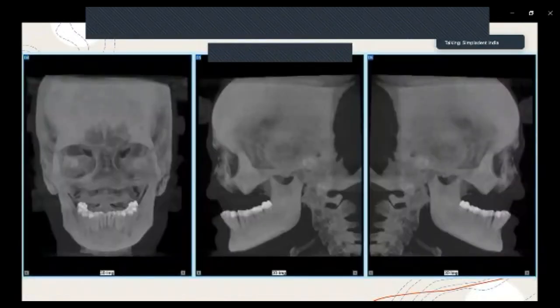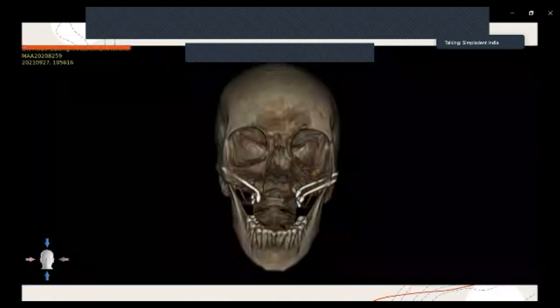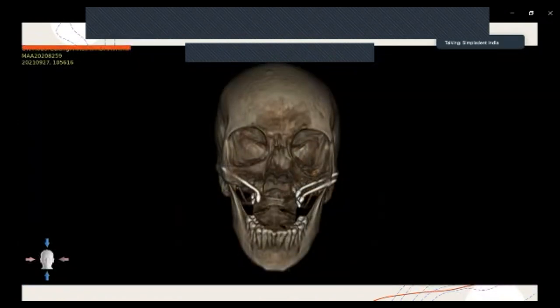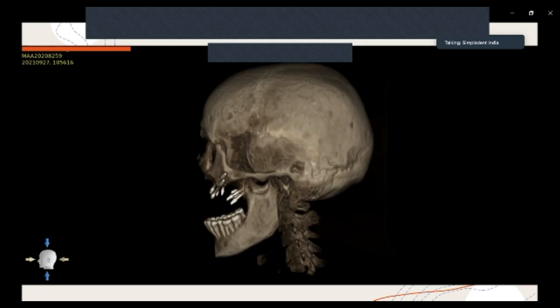With follow-up. Now one more case is there. As we're talking about, the glabella is always there, we're placing a glabella implant. This was the case where the mucormycosis has affected the glabella bone also, or the frontal sinus. So I was not able to do the glabella implant in this particular area. We did a very perfect double zygoma, pterygoids, everything we did, but the entire pontic span was there, and I'm facing a failure for this case.